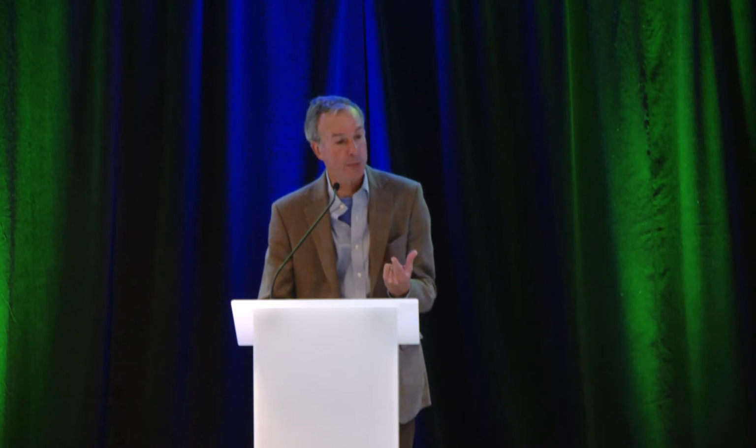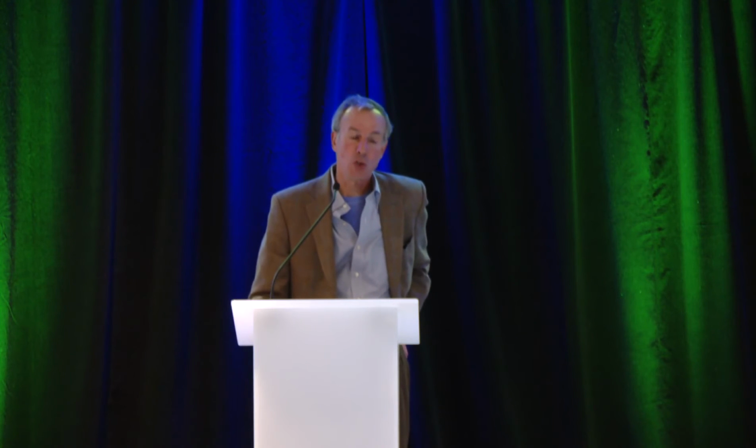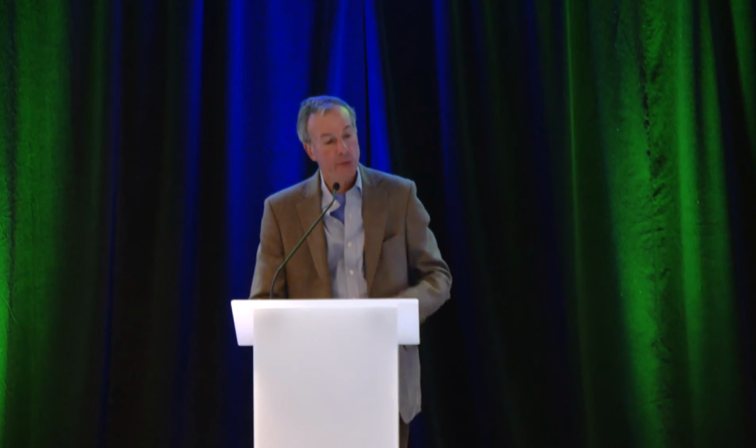So here there's no separation. You have a superimposed crural diaphragm on the lower esophageal sphincter, and you compute the EGJ DCI below there, and it's the EGJ contractile integral is how it's computed. If you have some separation, as in this case over here, now the LES-CD separation is 2, and you still compute the EGJ-CI using the DCI tool below.